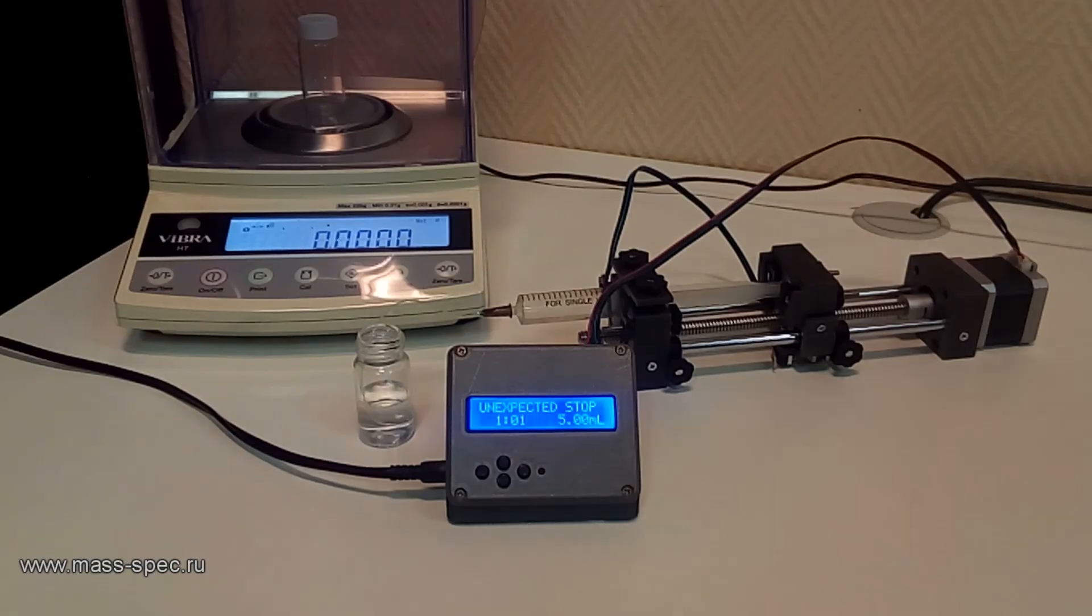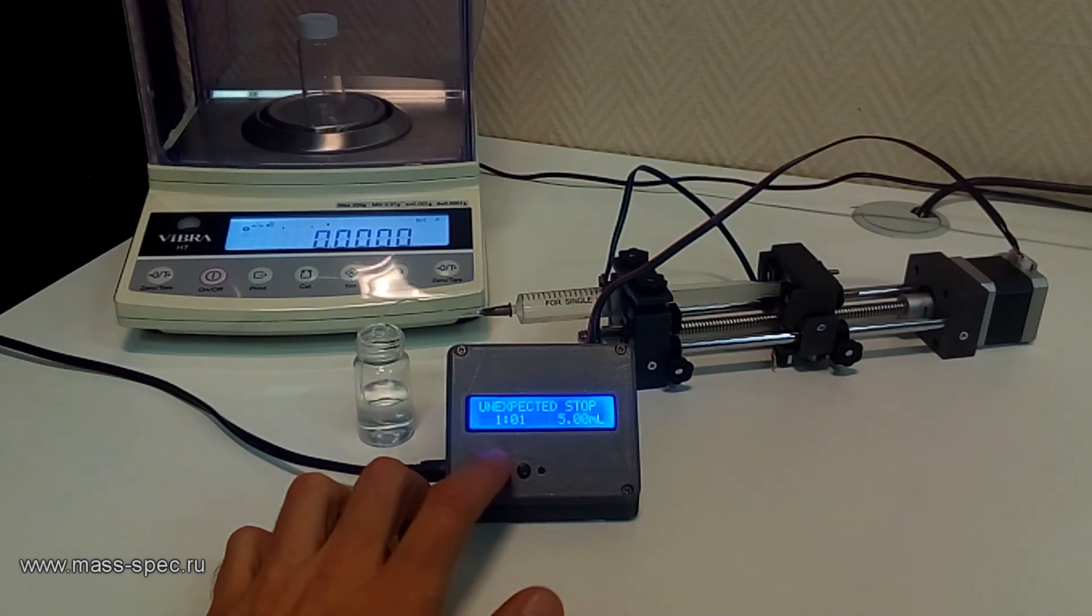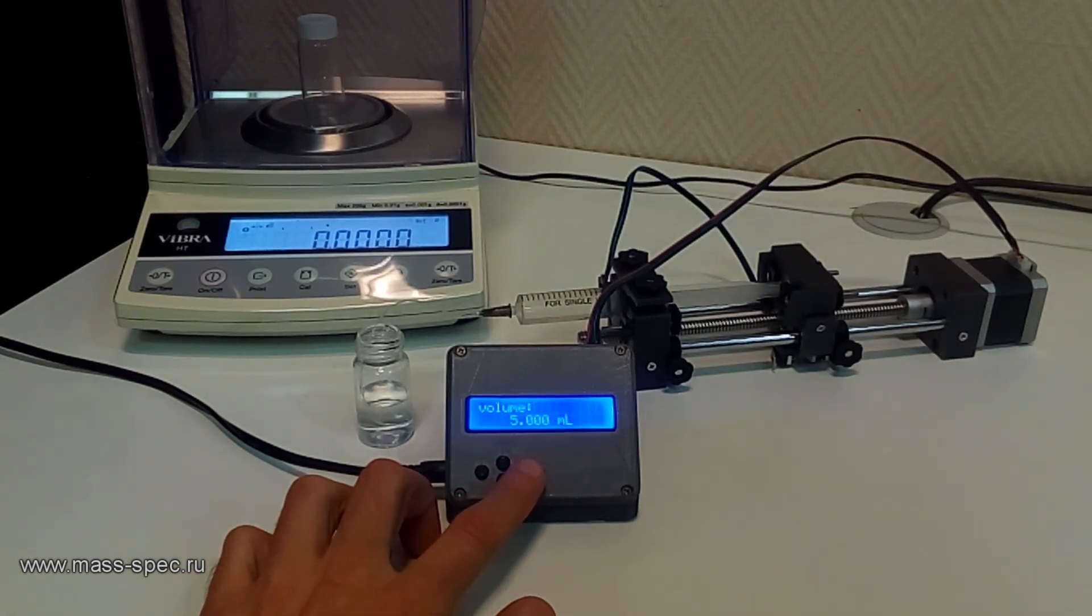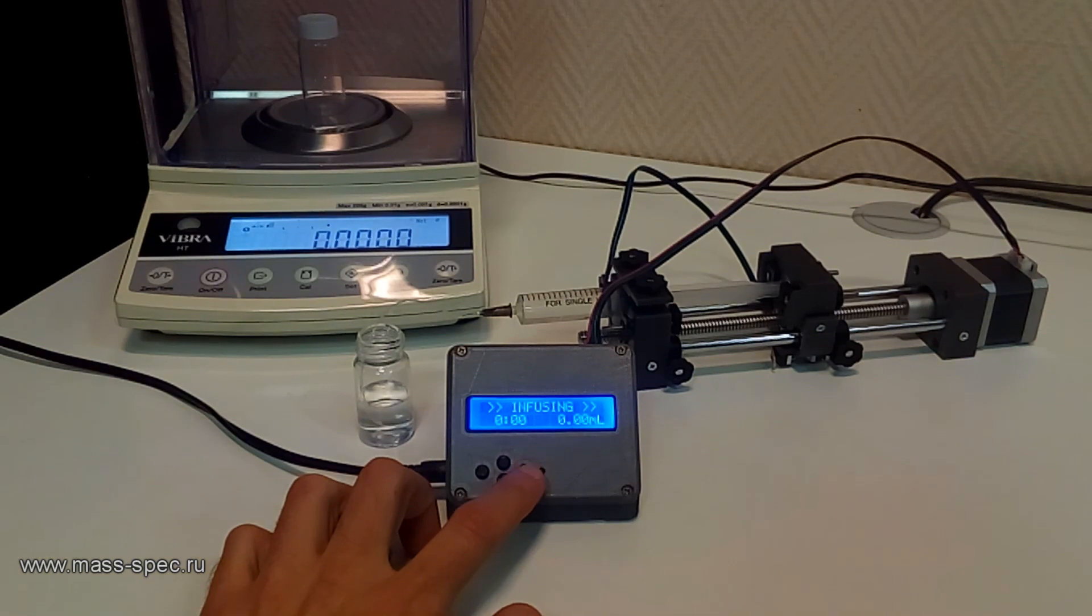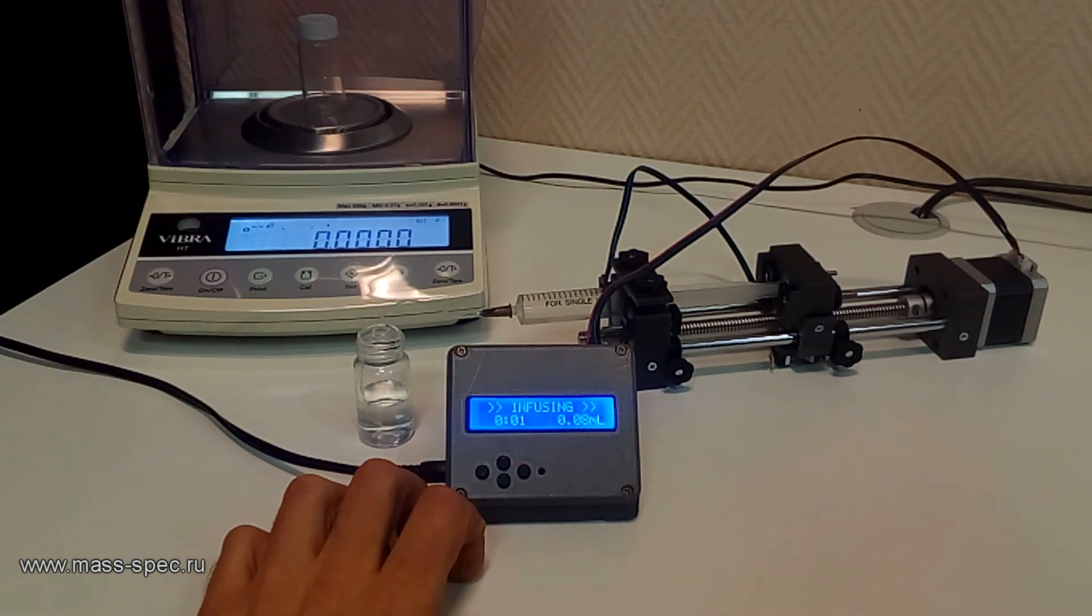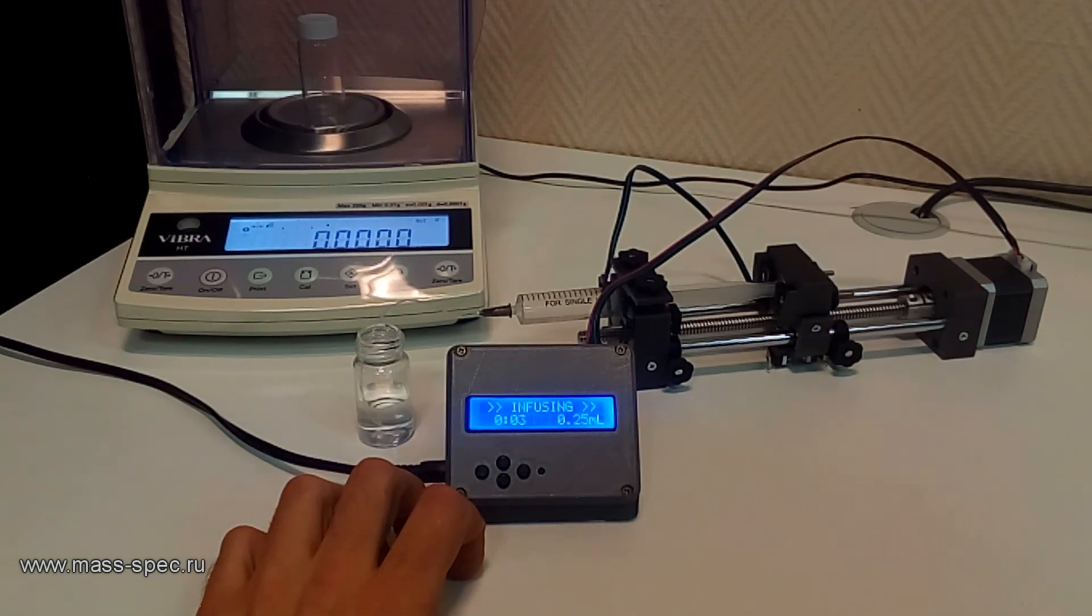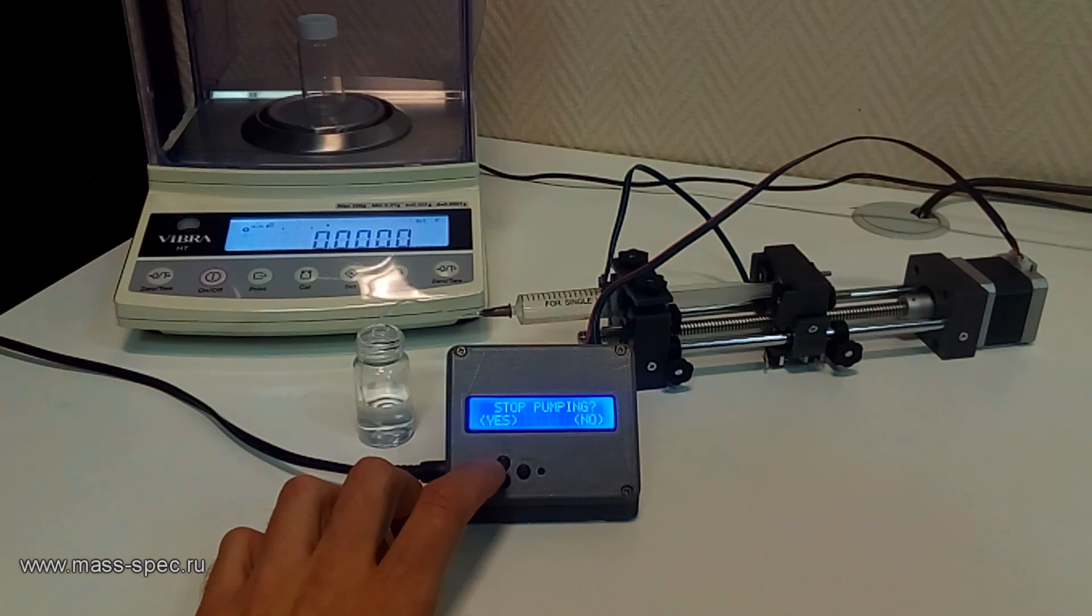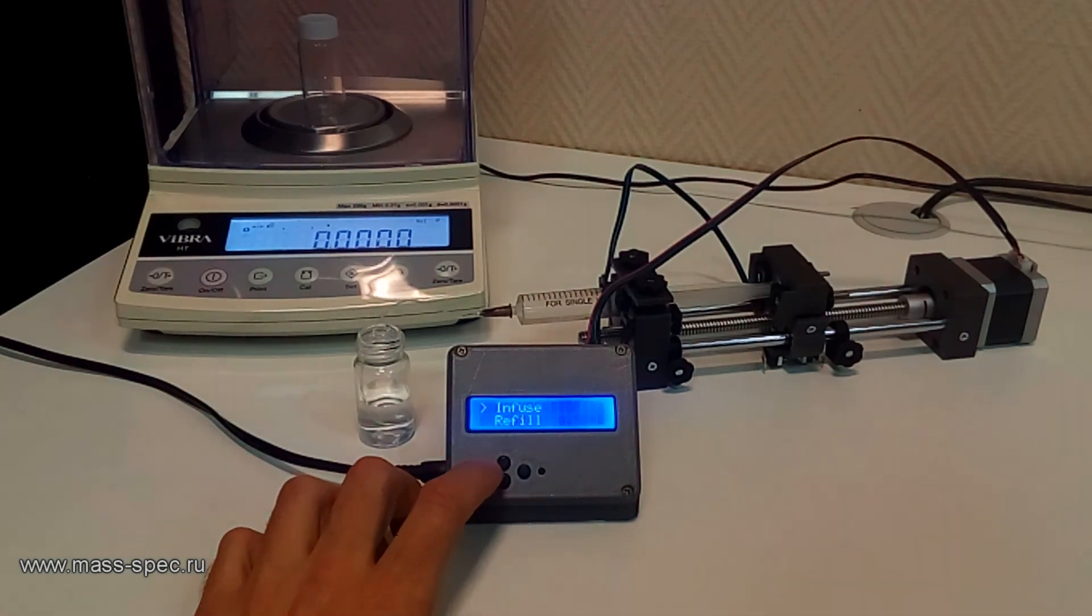The infuse mode is used to dispense fluid. The clearance between the lead screw and the nut produces a backlash or dead zone when the stepper motor changes direction of rotation. Therefore, to increase accuracy a small amount of water should be wasted.